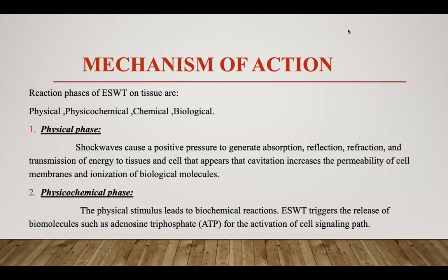Shockwave causes a positive pressure to generate absorption, reflection, and transmission of energy to tissue and cells, that appear as cavitation, increasing the permeability of the cell membrane and ionization of biological molecules. Number two is the physiochemical phase. The physical stimulus leads to a biochemical reaction.